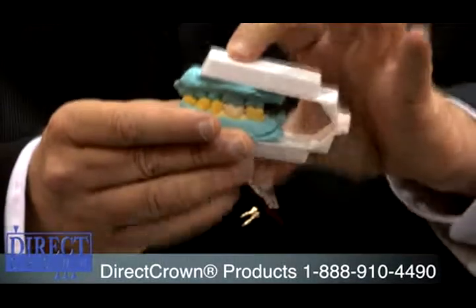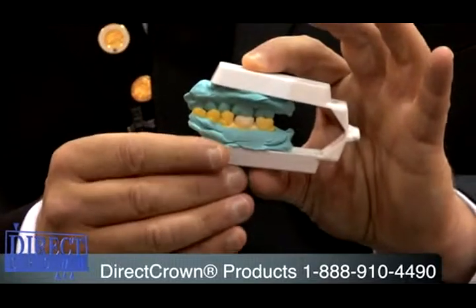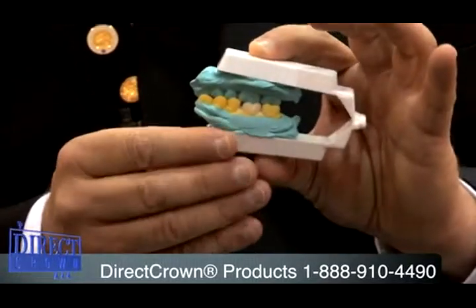And once you have decided on the crown shell that is going to fit appropriately onto the model, then what you'll do is go ahead and sandblast the crown form, the internal surfaces or any surface that you want to have polymerized, and you will paint your adhesive onto it, polymerize it, add your composite to it, and then place it back on your model, teasing it down so that it's seated completely, verifying that you have the model closed appropriately, and then cleaning any excess up.